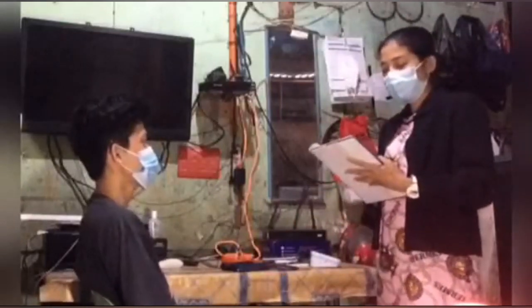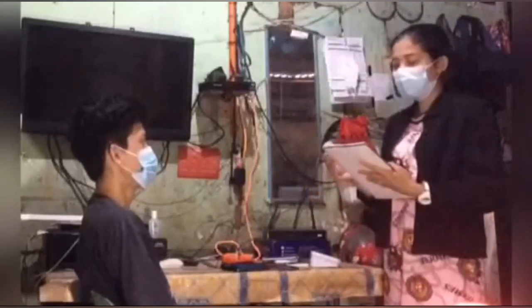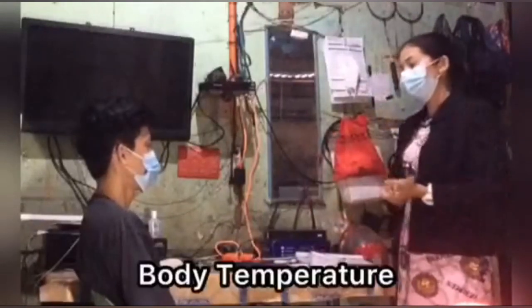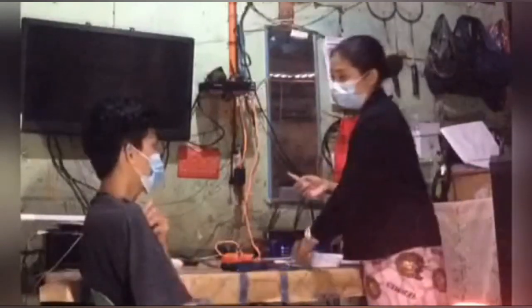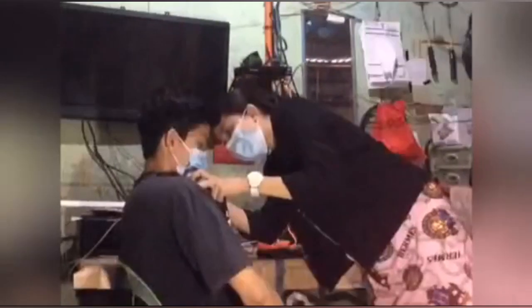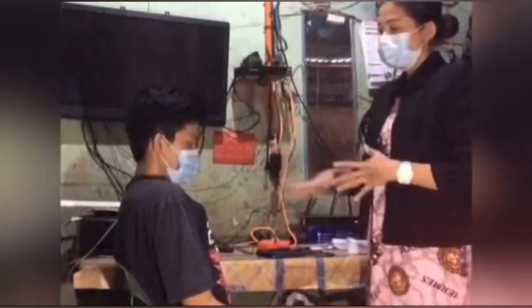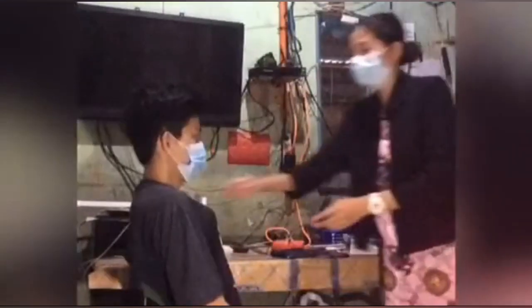Just to verify, your name is Jeff Bacolod. Yes, ma'am. And your age is 22 years old. Yes, ma'am. First, I will check your body temperature. We have a digital thermometer, which is like this. Let's wait for 2 minutes or until it makes a beep sound. It is beeping now.